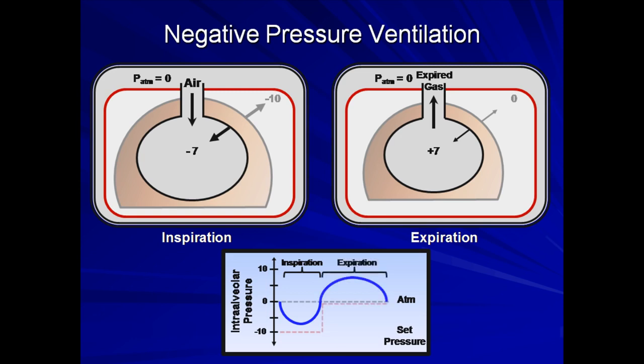During expiration, the set pressure goes to 0. This triggers a smooth increase in intra-alveolar pressure to some positive value, which pushes gas back out until the pressure then again returns to 0.